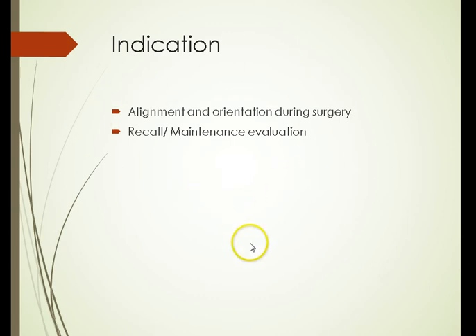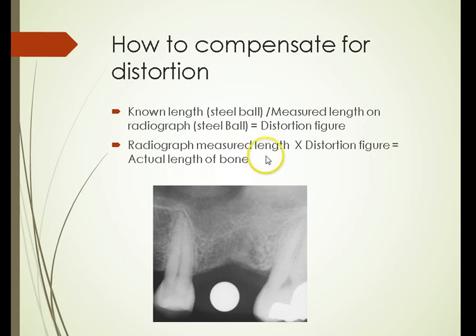But with the method we talked about, how to compensate for the distortion, if you use this formula and have a known object, you can also get a very good result regarding the space.